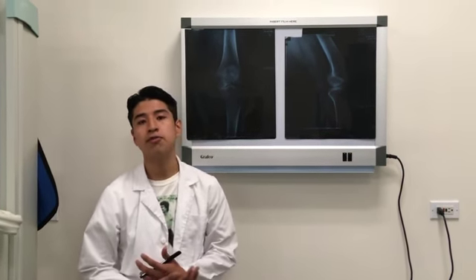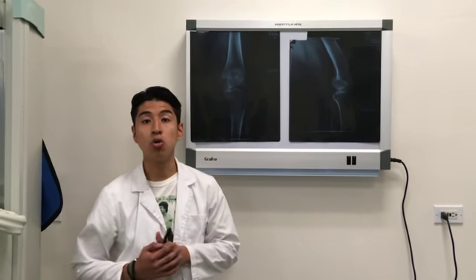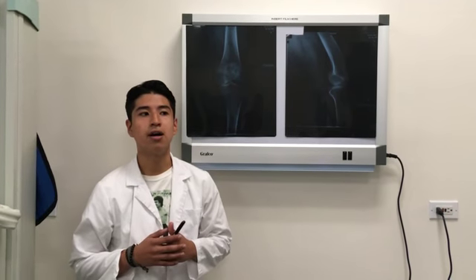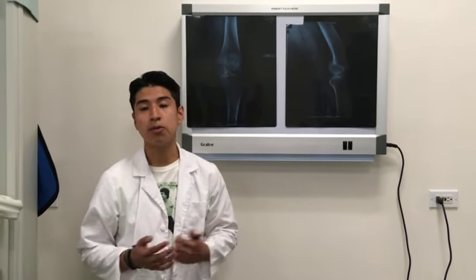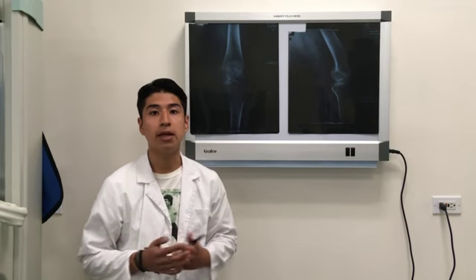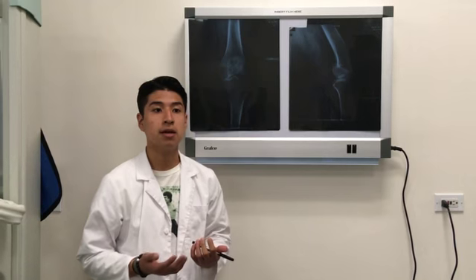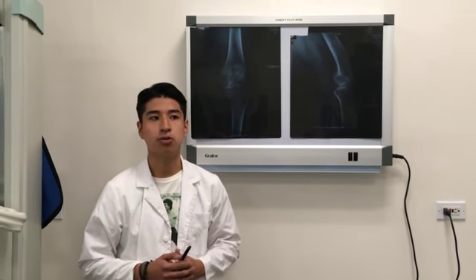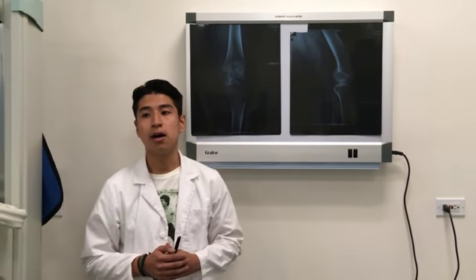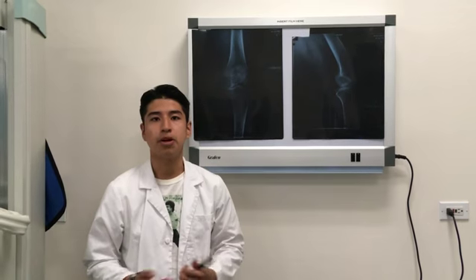Now, when I received all this information, the history, and what I observed, the goal in regards to patient care was to not add on to the pain that she was feeling. So this meant that when I was going to position her, I had to work efficiently. As the patient was hypersthenic, I also observed that she would run out of breath really fast. So in regards to positioning, I didn't have to move as fast just to help her keep up.